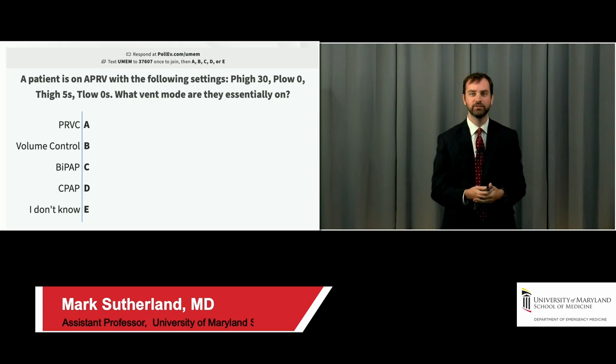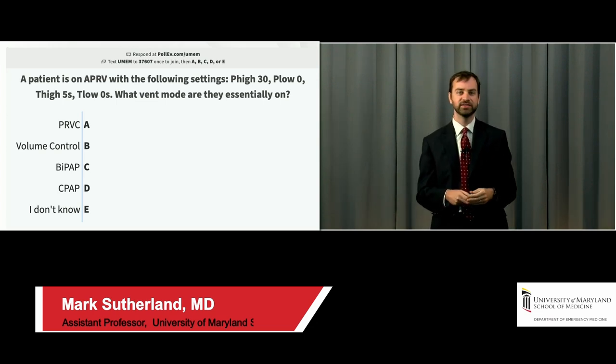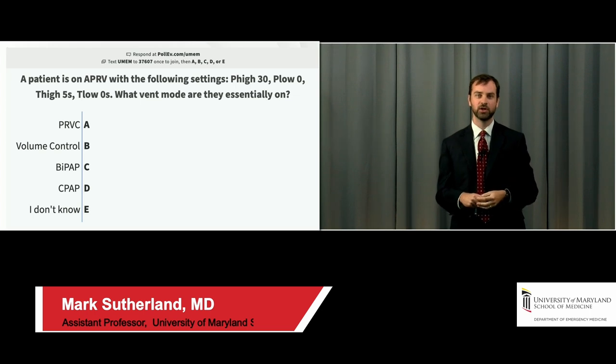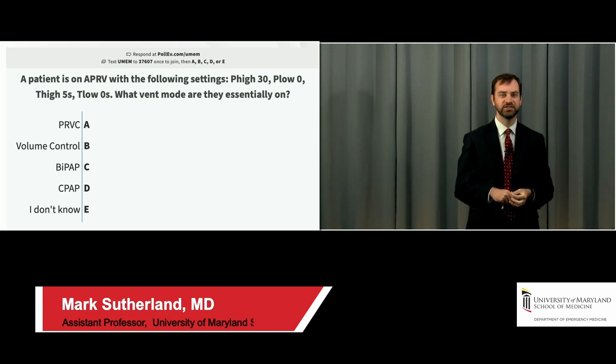A patient is on APRV with the following settings: P high 30, P low 0, T high 5 seconds, T low 0 seconds, not 0 point something, 0 seconds. What vent mode are they essentially on? Your options are PRVC, volume control, BiPAP, CPAP, or I don't know.